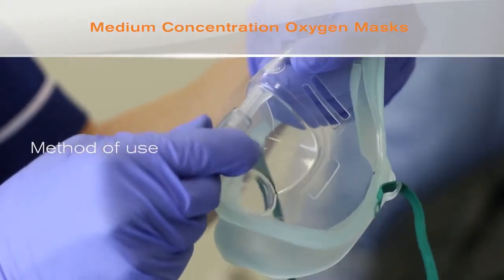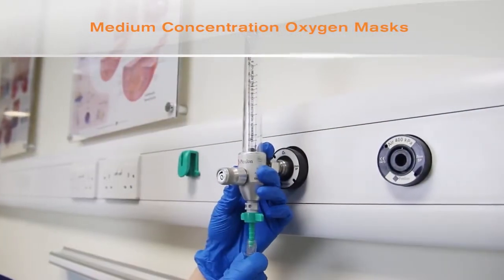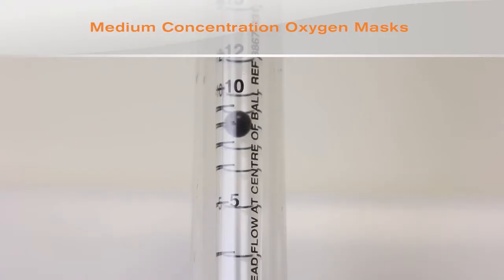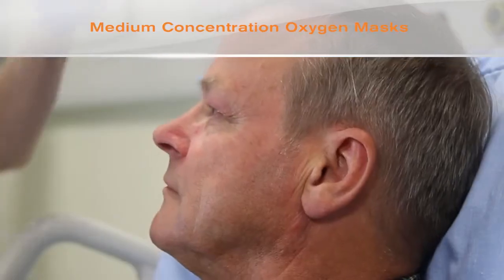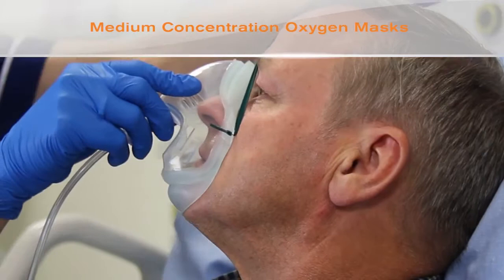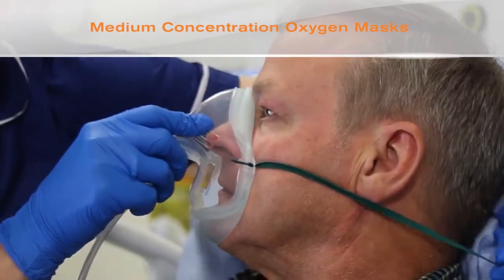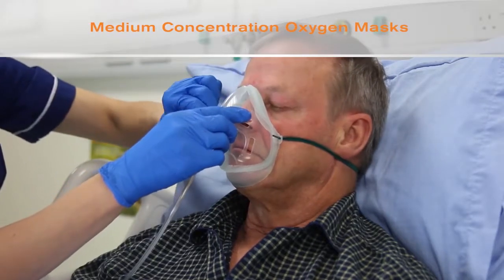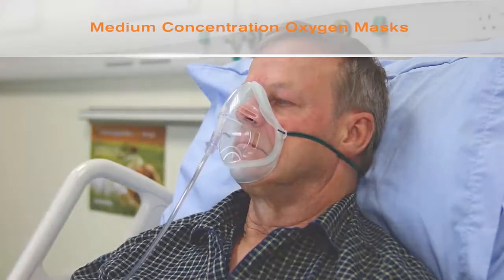One end of the oxygen tube is attached to the spigot on the mask and the other to the oxygen flow meter. The flow meter is set to give the prescribed oxygen concentration. The mask is then fitted over the patient's nose and mouth and the elastic tightened to give a secure and comfortable fit. The elastic historically has been secured over the ears.